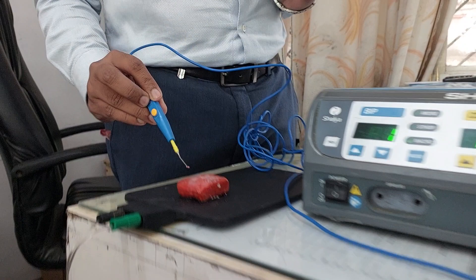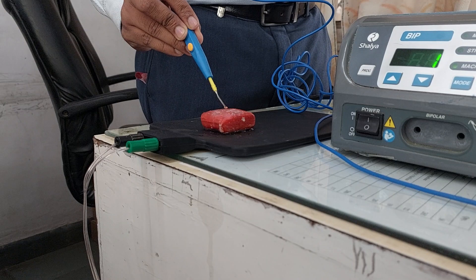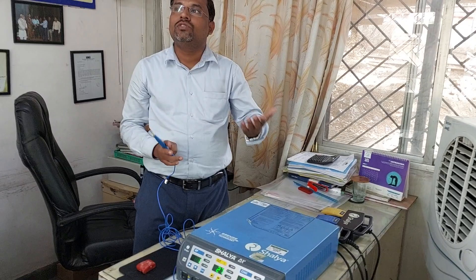You can observe the sparking on the sponge. I am going to increase the value again — you can observe the sparking clearly. In this way you can check whether the cautery is working or not before using it in procedures.